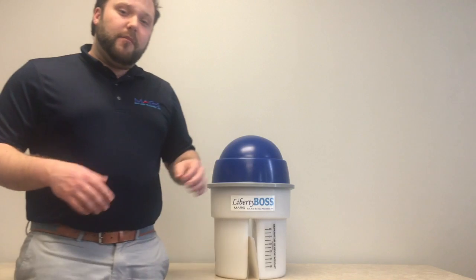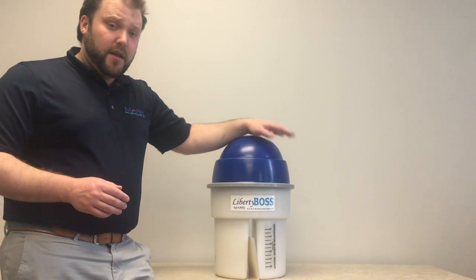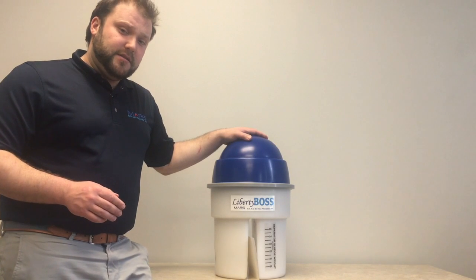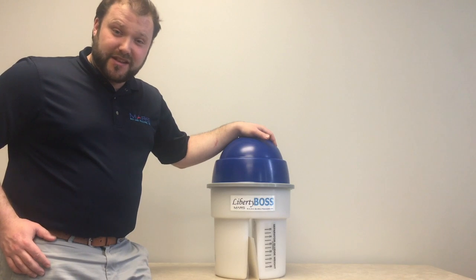A month before your system is due, Mars will send you a notification letting you know that we need to send you a new unit. A new unit is sent to your practice, you pull out the old unit, install the new unit, and you're good again for the service life.